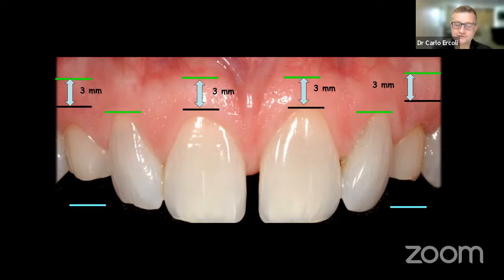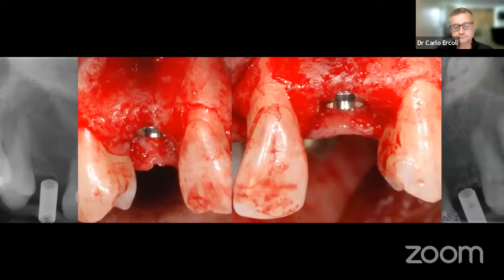However, as is often the case with congenitally missing teeth, once you open that flap, you always find that the bone is located too coronally. So if you lose sight of the ideal implant position, you're going to place that implant way too coronal. Realistically, what you need to do, again, is project where the scalloping of that bone should be, or should have been, in case you actually had a tooth in place in that area, I mean, a permanent tooth.